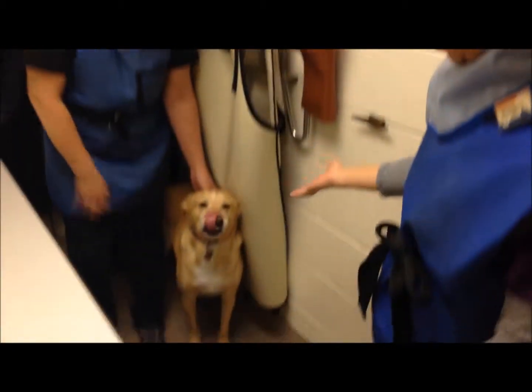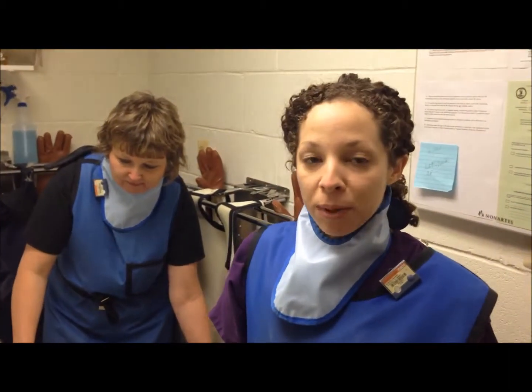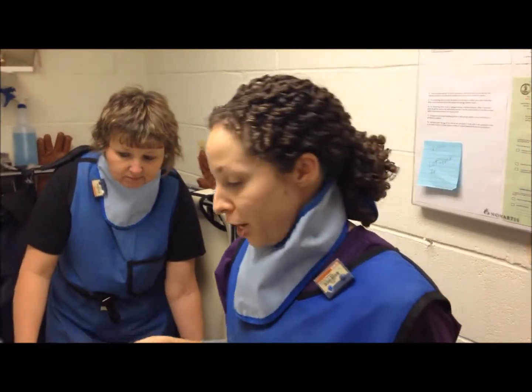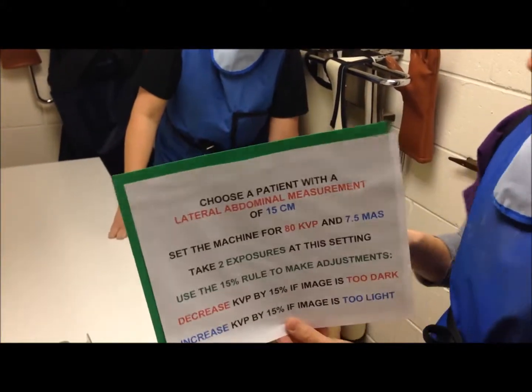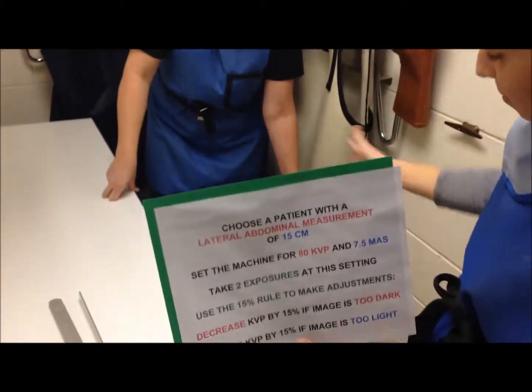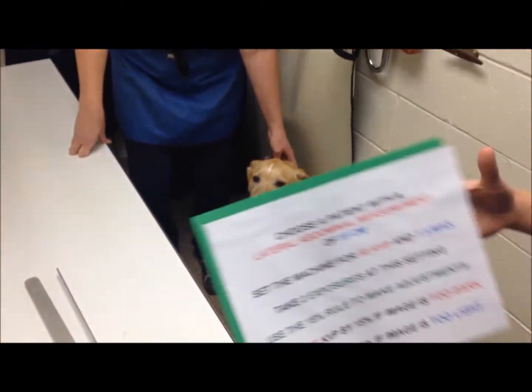This is my dog Reese. She's going to be our subject today. And basically the best place to start when you're going to be making a technique chart for radiology in your practice is you want to choose a patient that has a lateral abdominal measurement of 15 centimeters, which Reese is mid-size enough that she should be appropriate for that.